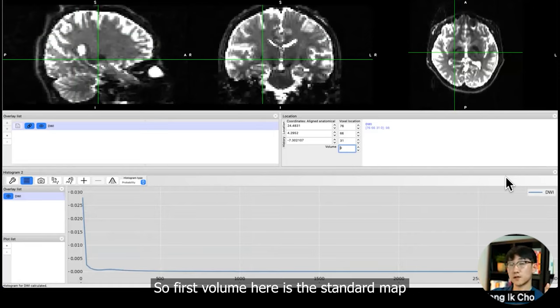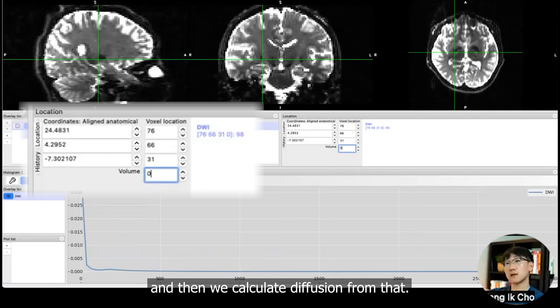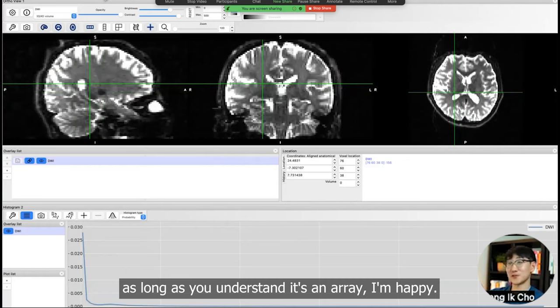I told you before the diffusion weighted image is a bunch of 3D maps concatenated together. This map is brighter. The first volume is brighter than the other maps. The first volume here is the standard map called B0 map in diffusion. What we do is we compare intensity attenuation in each volume compared to the first B0 volume, and then we calculate diffusion from that.